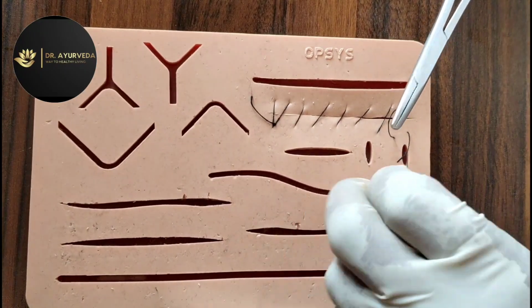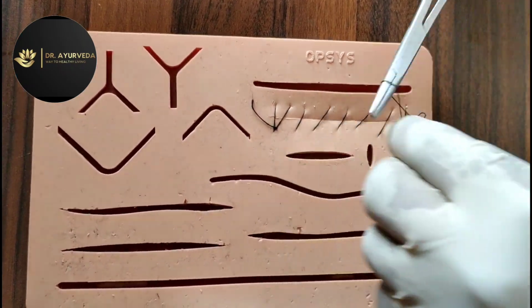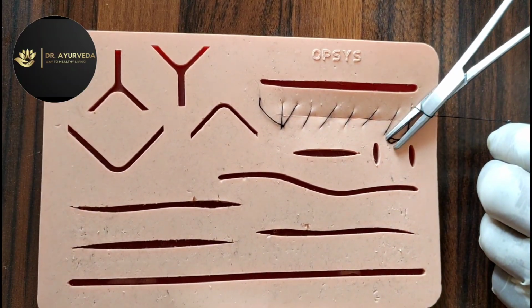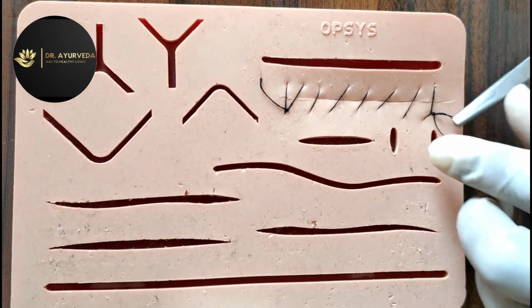The continuous suture can also be locked. Continuous suture locking is accomplished by placing friction points along the length of the wound to reduce the tendency of the suture to loosen when placing the rest of the suture. Suturing is continued by passing through the previous stitch.